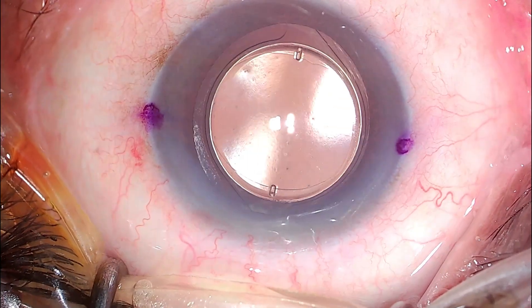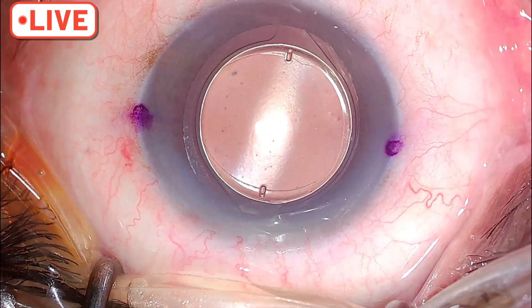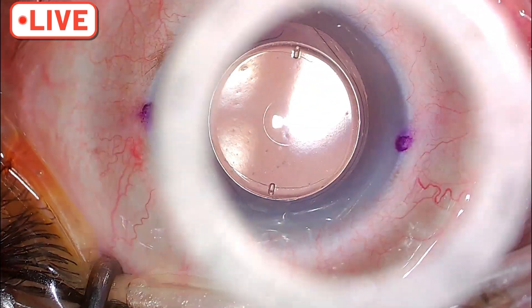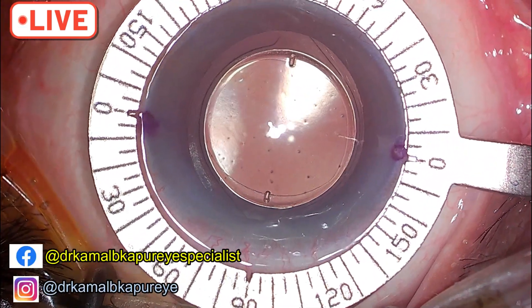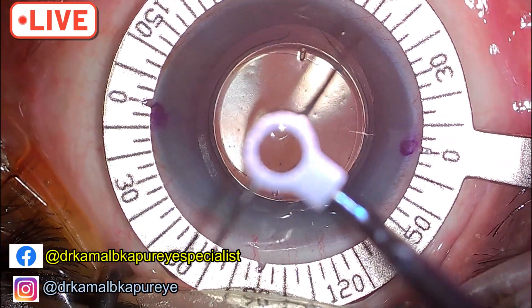Toric IOL redialing. This patient had required the toric IOL at 65 to 70 degrees — I believe it was 70 degrees — and the IOL has probably rotated, so I am planning to mark my 70 degrees here.